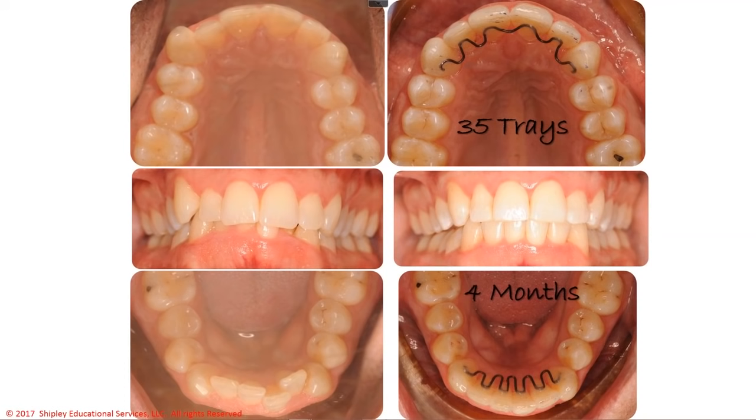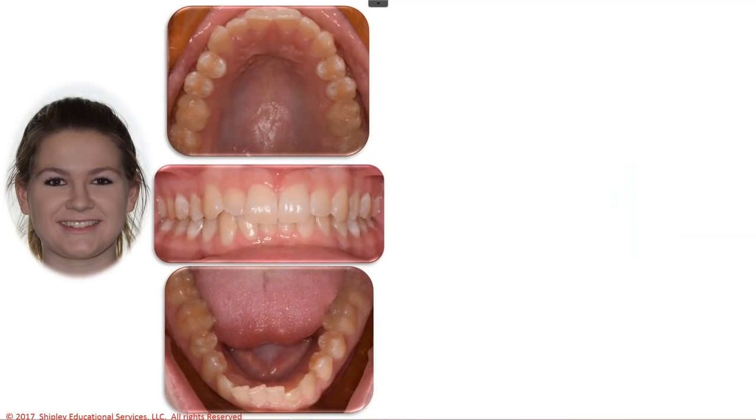So this is what we were able to do early on with the MOPS and with the Invisalign treatment with 3-day aligner changes. More recently, over the last 9 months to a year, I guess I would say, I've been working with the V Pro 5. So here's a V Pro 5 case. This is another Invisalign case.